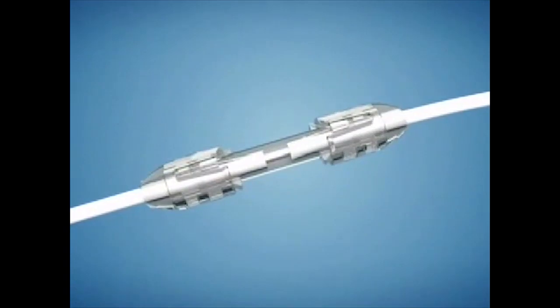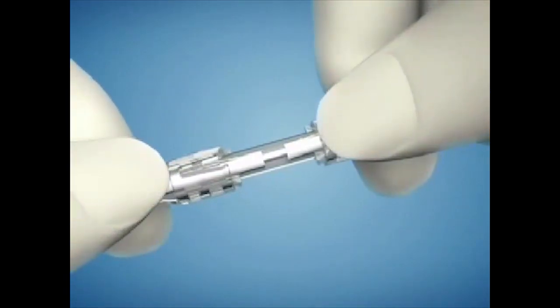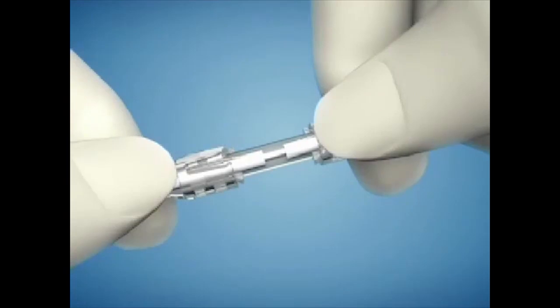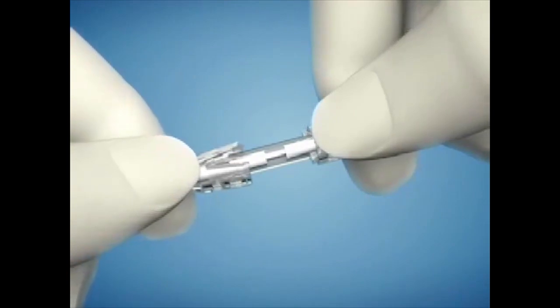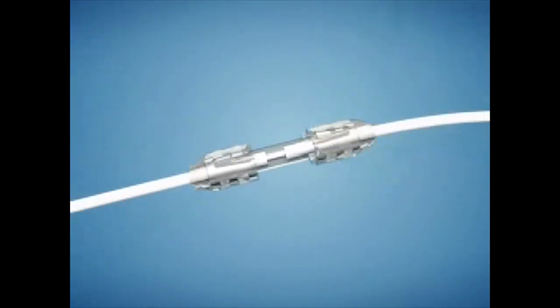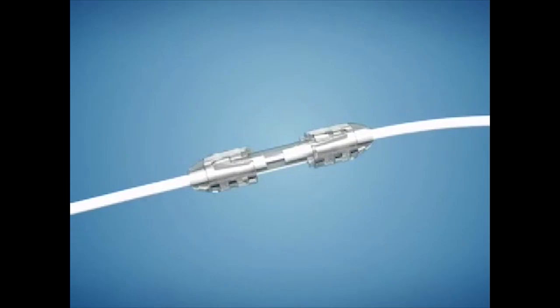Firmly grasp the collet that is over the spinal segment, and with the fingers of the other hand, grasp the tapered portion of the collet that is over the inserted pump segment. Push the pump segment collet towards the center of the catheter connector until you hear and feel the collet click into place. Maintain a firm hold on the collet that is over the spinal segment and tug on the pump segment to check that it is firmly attached to the catheter connector.